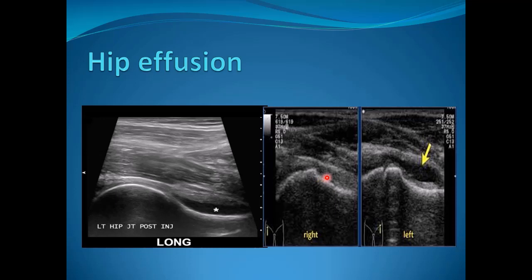This is the femoral head and neck, and this is the anterior recess where we see the effusion. This is the normal side — the normal right side shows no joint effusion, while on the left side we can see a clear hypoechoic joint effusion. We can measure the anteroposterior diameter for documentation and follow-up to assess progression or regression.